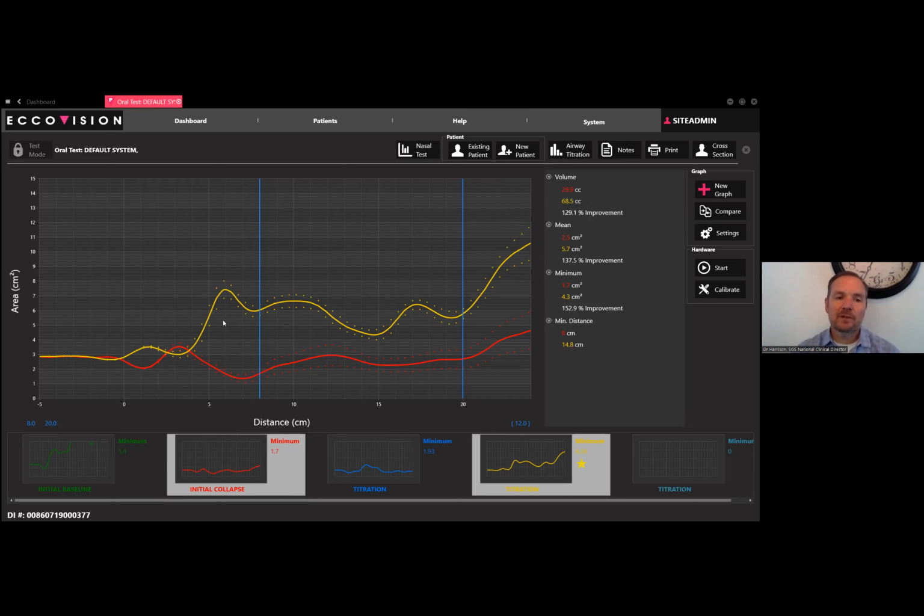The spike that we see over here was the increase in verticals, as the roof of the mouth got higher. Now we have to be cognizant of lip patency. If we make a device that has a lot of anterior vertical, but we start them mouth breathing, now we've got another issue that we need to resolve. So there are thinner materials now.